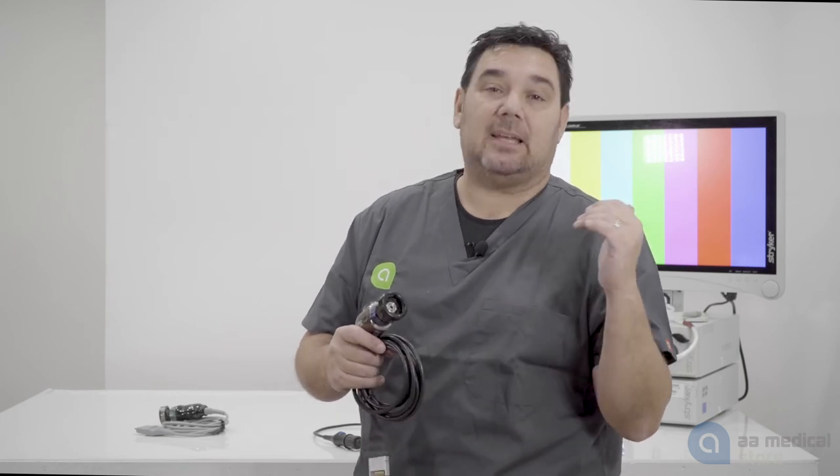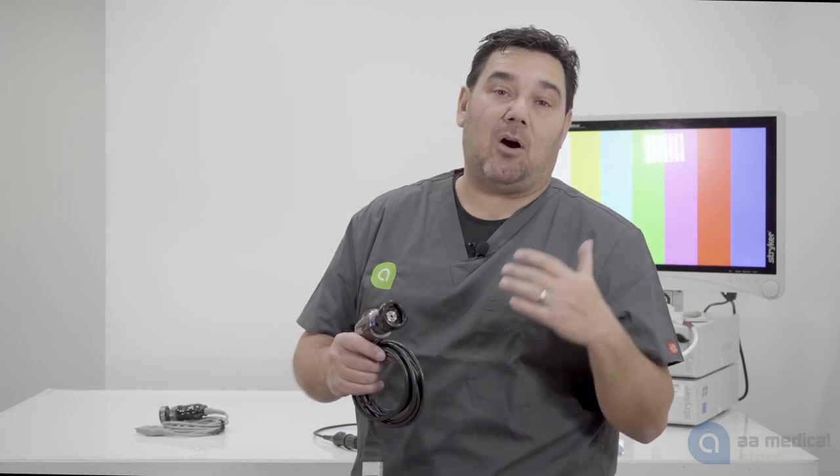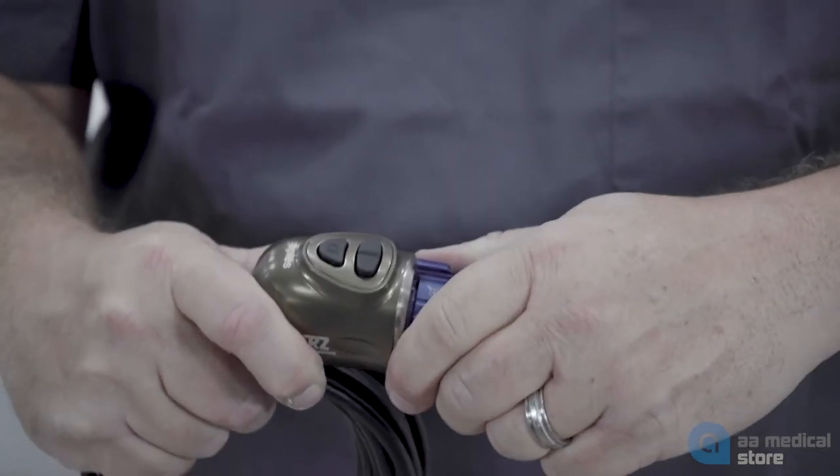The one thing you want to make sure if you want to use a direct coupling arthroscope is that your camera system would be able to attach the scope to the camera head. Here's an example of a Stortz H3Z camera head, and the coupler does not come off the camera head.